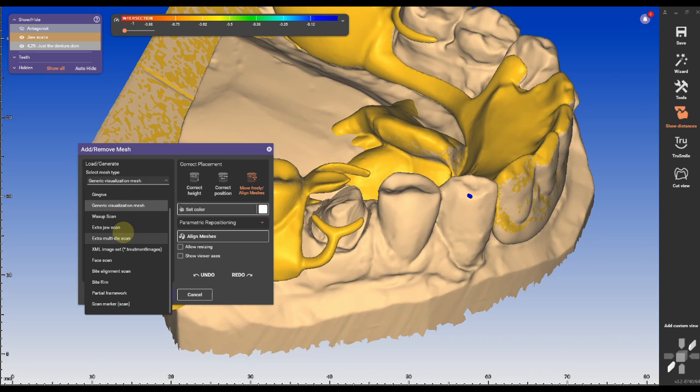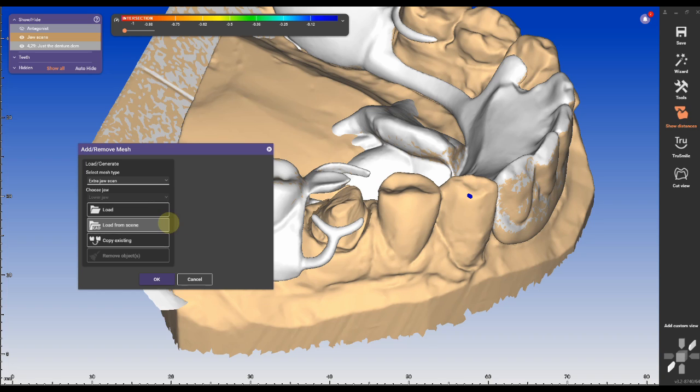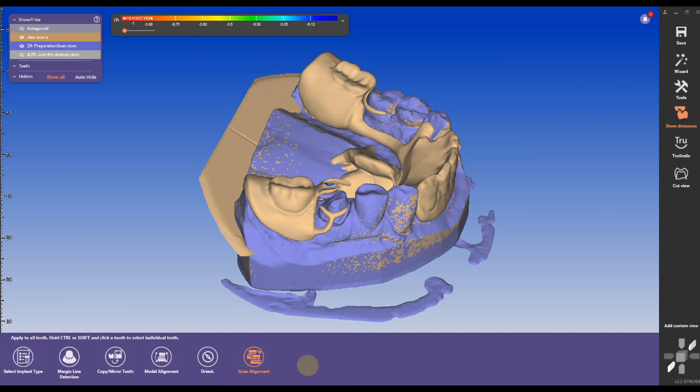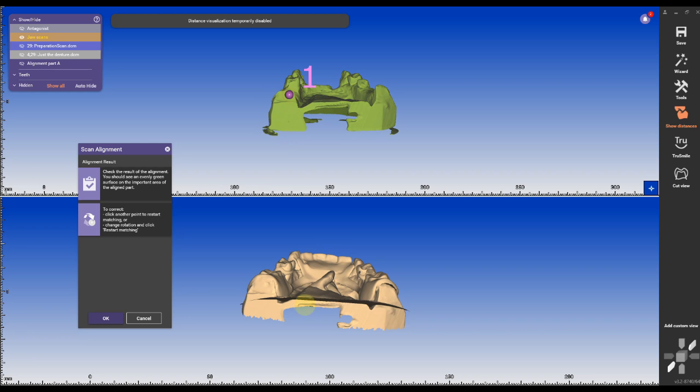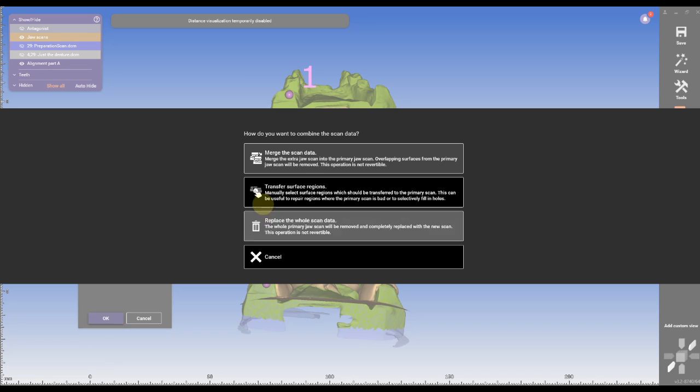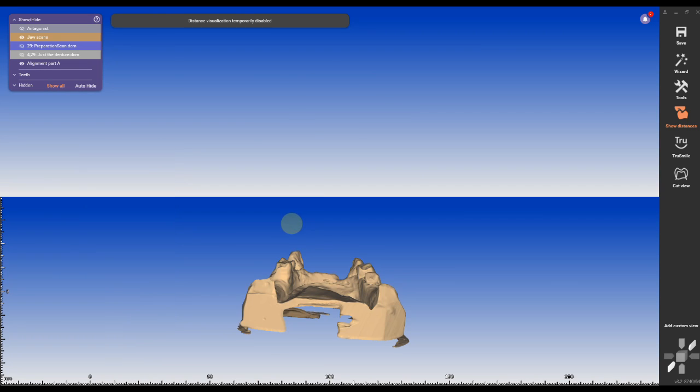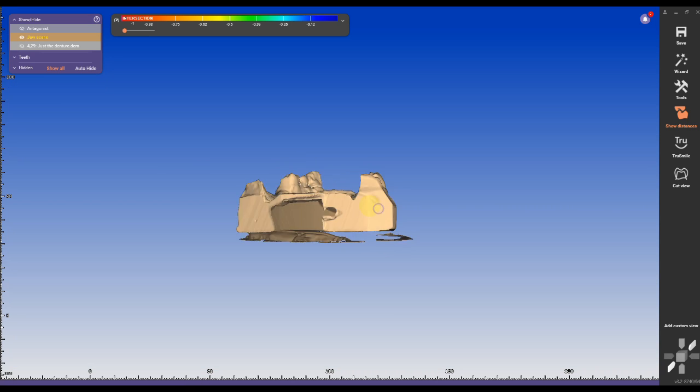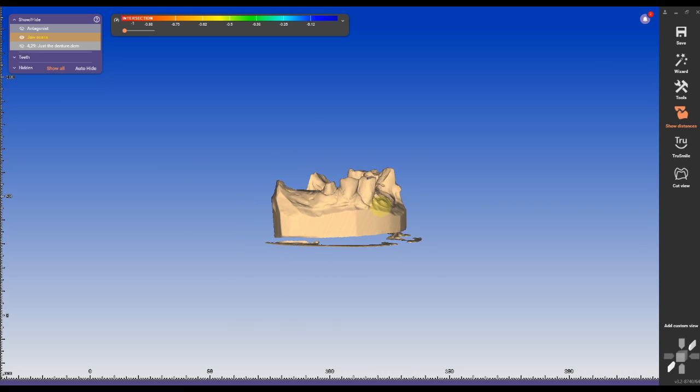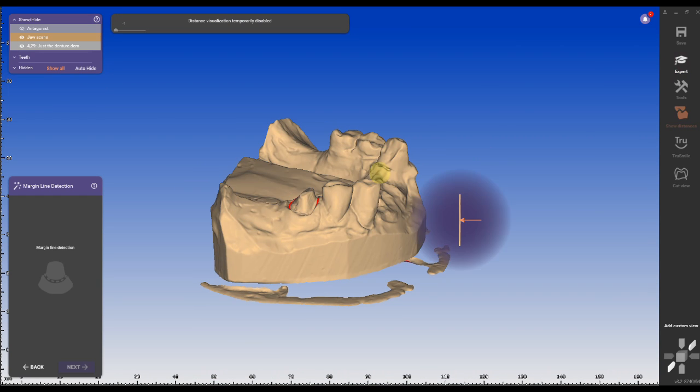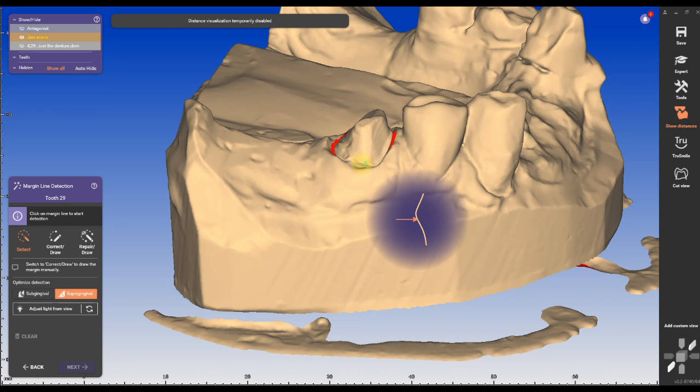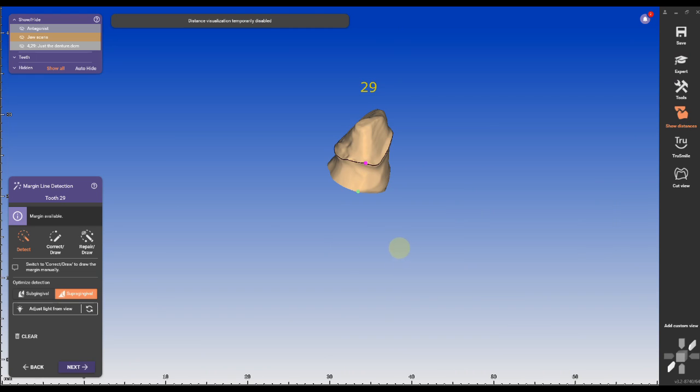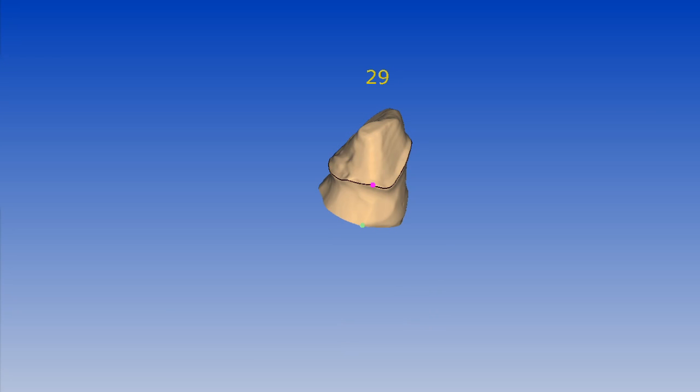Again I'm importing the extra jaw scan and loading my original jaw scan, aligning it and swapping it out with the entire scan data. Now I'm going to the crown design again and using the separate partial scan as a guide.